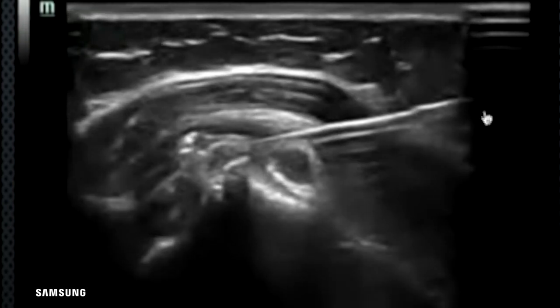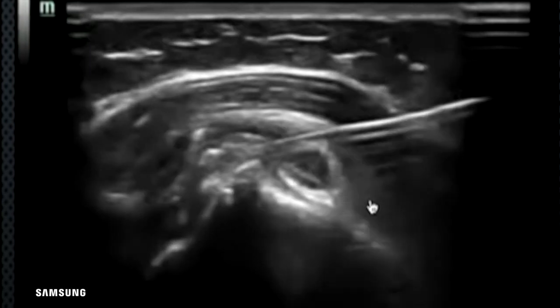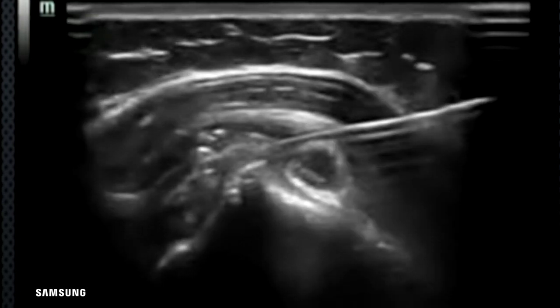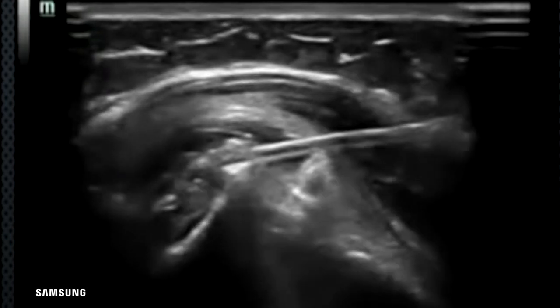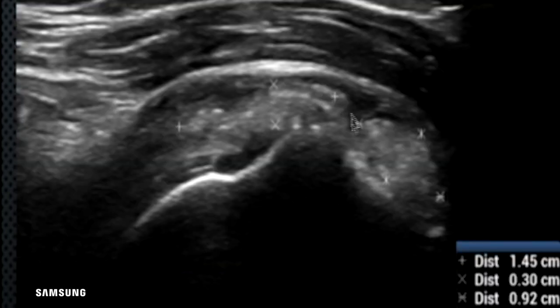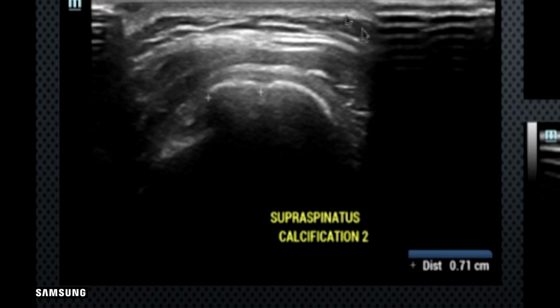After the pulsing maneuver, the majority of the calcification comes out into the syringe. Sometimes if it does not come out into the syringe, it will go into the bursa and get automatically absorbed. You can see here that the majority of the calcification has gone. Whatever is remaining is pulsated with normal saline. This is how we remove and break down calcification within the rotator cuff.